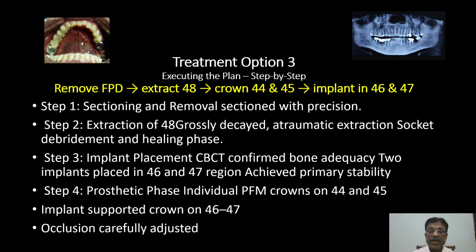So I reiterate once more that when 14 micron articulating paper is used, it marks the natural tooth more compared to the restoration placed on the implant, to compensate the difference in movement of natural tooth and implant. This is very important.